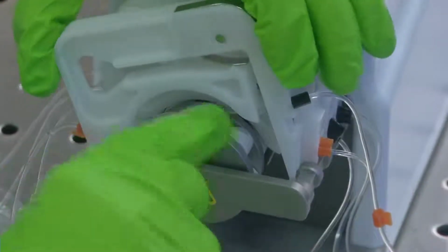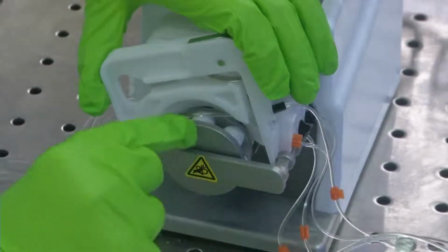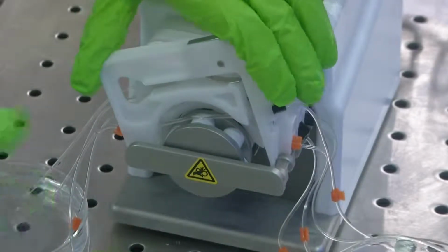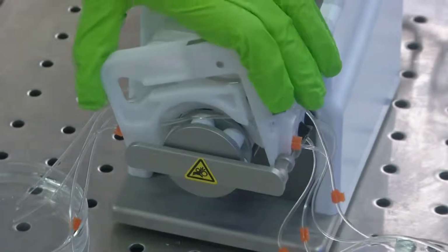So as it moves from this point to this point, it relaxes, resumes its original shape, comes back to the original diameter, and the compression is on the roller point. This creates a vacuum and suctions the liquid, and then the entire process repeats.